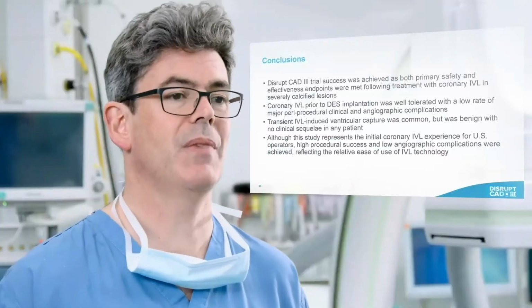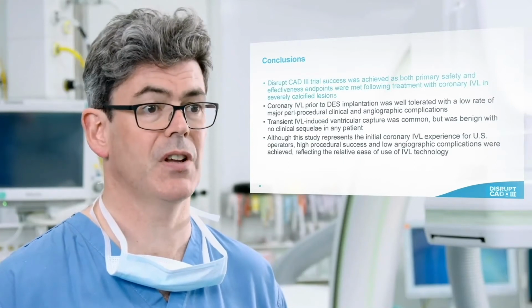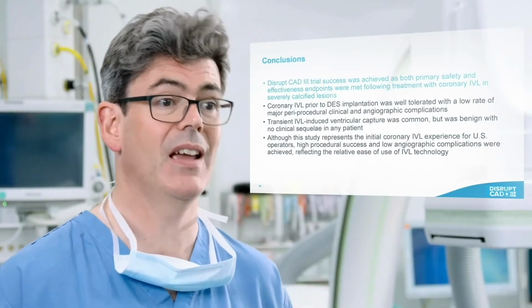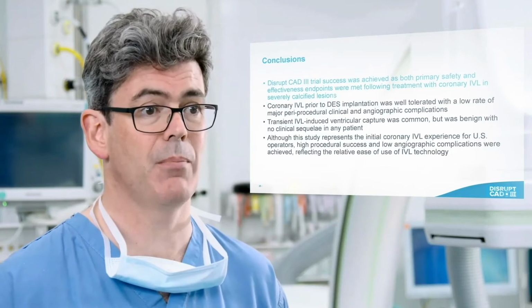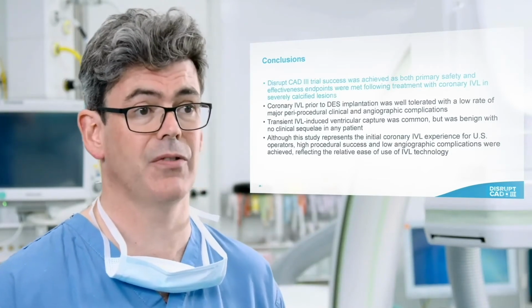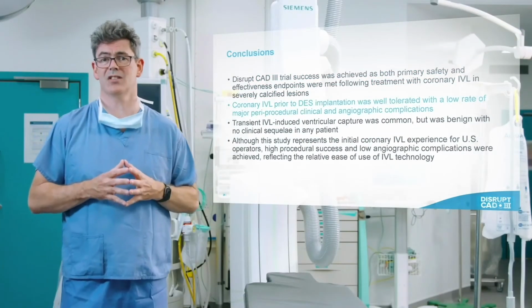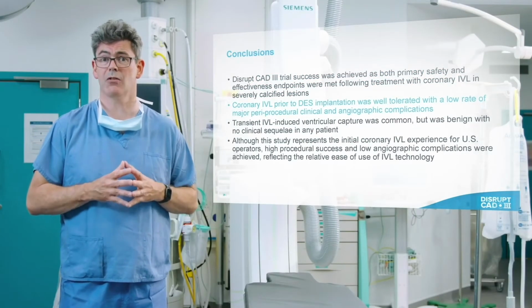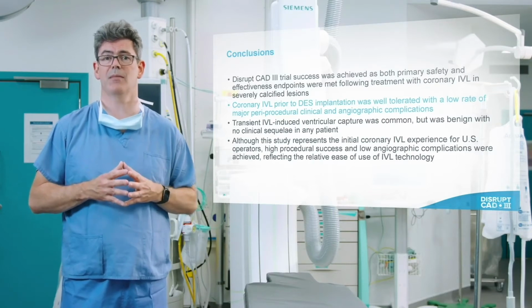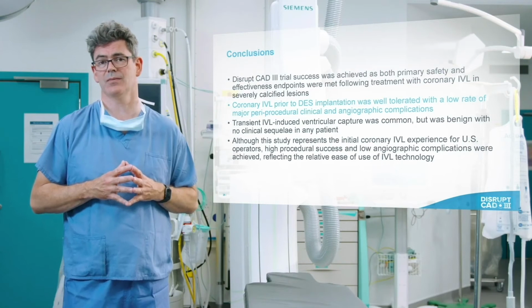In conclusion, I'd say that the success of the Disrupt CAD3 trial was achieved, as both the primary safety and effectiveness endpoints were met following treatment with coronary IVL in severely calcified lesions. Coronary IVL prior to drug-eluting stent implantation was well tolerated, with low rates of major periprocedural clinical and angiographic complications.